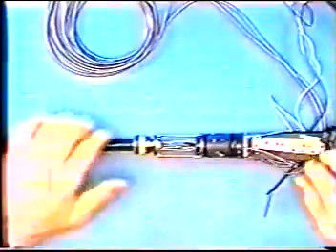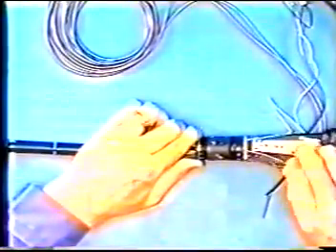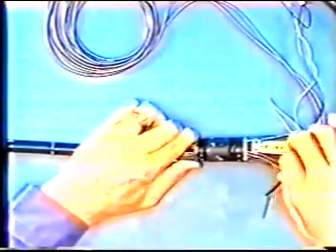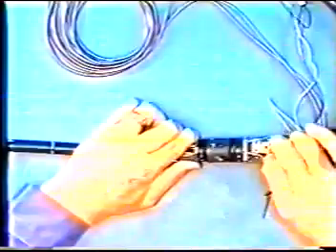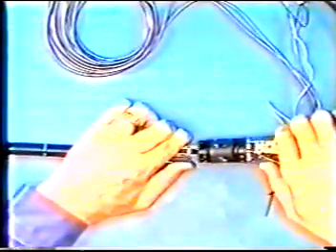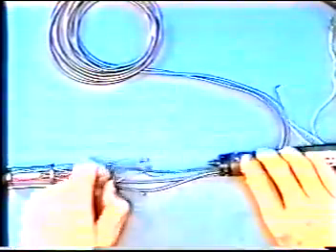Disassembly of inserting sections. Pull out inserting section slowly. Keep your eyes on the sleeves so that the angulation wires won't get stuck. After angulation wires come out, pull out the cable and light guide carefully.